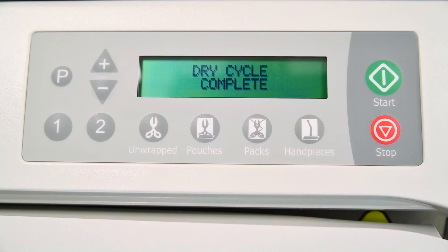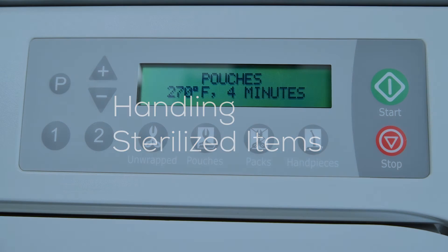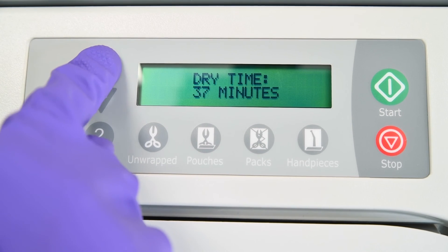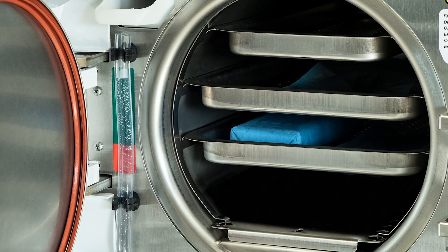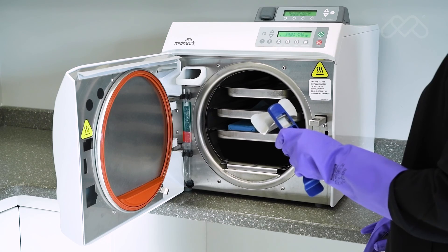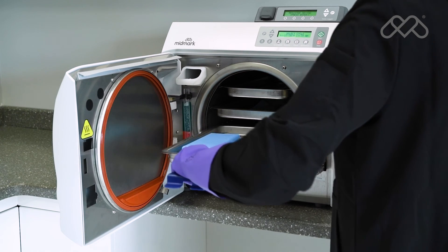After sterilization is complete, all items must be handled appropriately in accordance with all relevant processes and guidelines. Before removal from the sterilizer, it is critically important that all items and packages be completely dry. If packages are not dry, the operator may add additional drying time to the cycle as described previously. Unwrapped items should be transported immediately and aseptically from the sterilizer to the point of use. Wrapped items may also be stored in a protected storage area until they are needed. Remove trays and cassettes using the Midmark-approved Tray and Cassette Removal Tool, holding the tray level and slightly elevating it to prevent it from shifting and becoming dislodged.